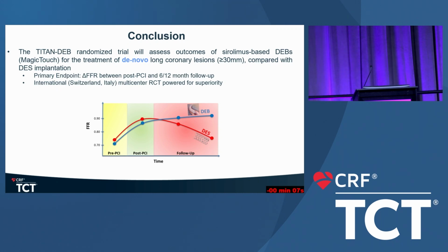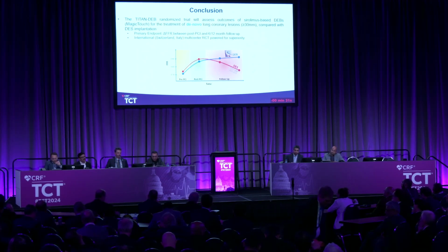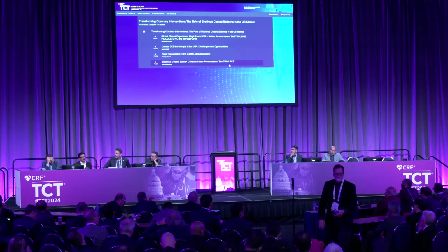So Marco, maybe I can ask the first question. This is one of the first times I see, I guess your study is similar, but where the primary endpoint is physiological, really, to see what the change in FFR is going to be, rather than an angiographic endpoint or clinical endpoint. So maybe a little bit for the audience, what made you change from the traditional endpoint to this?